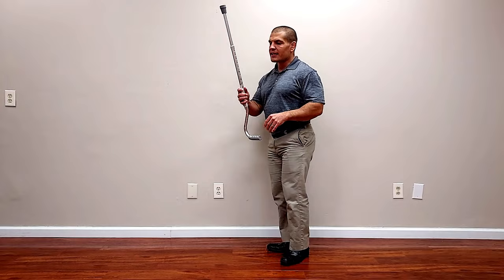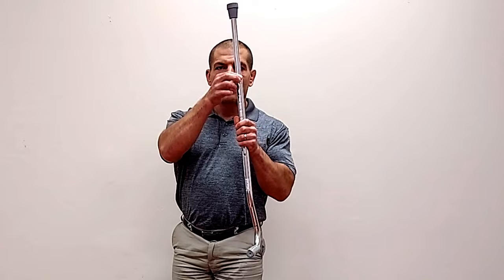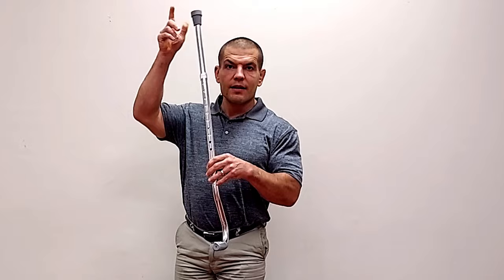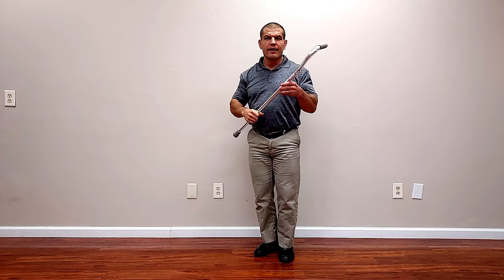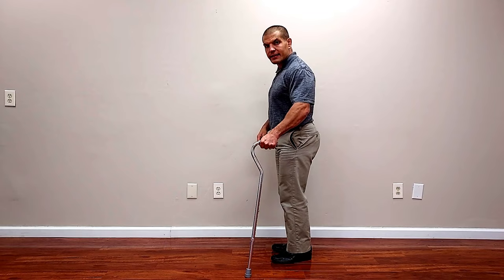To adjust the cane, get an adjustable cane, not a one-size-fits-all wooden cane. Push the button in — most will have a little knob that you want to make sure is loosened up so you can adjust the cane up and down. Push the button in and slide the tip of the cane in to make it shorter, or pull the tip out to make it longer. Now this is about right: a slight bend in my elbow with the cane six inches out to the side, six inches in front, and right about at the height of my hip bone.